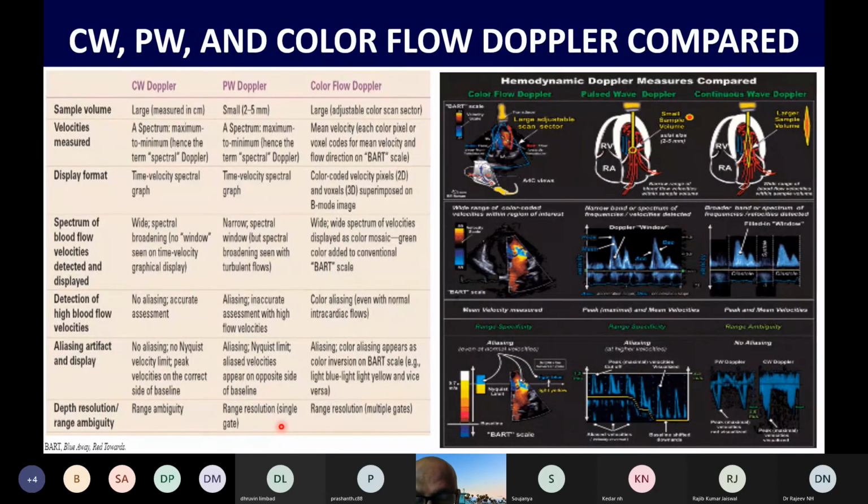When you talk about the left ventricle, we have the lateral and septal myocardial velocities. These values range from 8 to 10, 8 to 12 centimeters per second. The same thing can be applied for the right ventricle, and the S wave velocities indicate systolic function, whereas the diastolic waves E prime and A prime will represent the diastolic function.